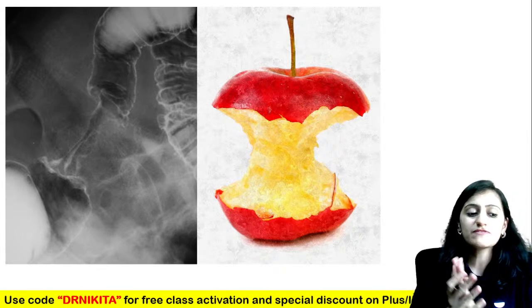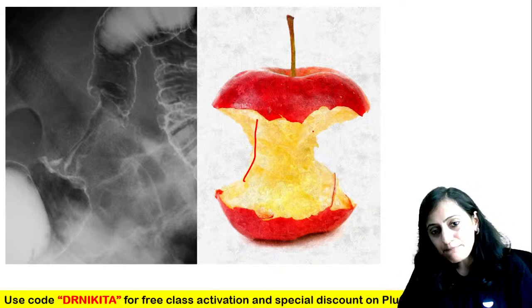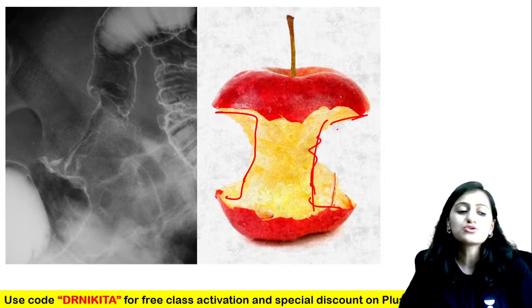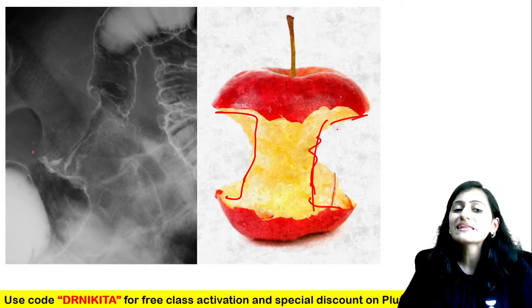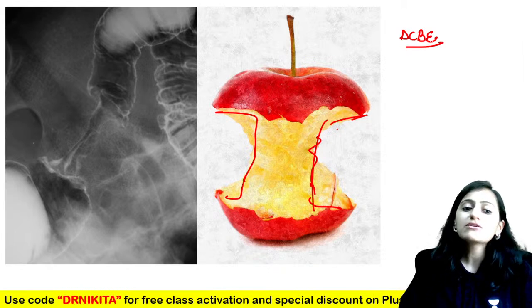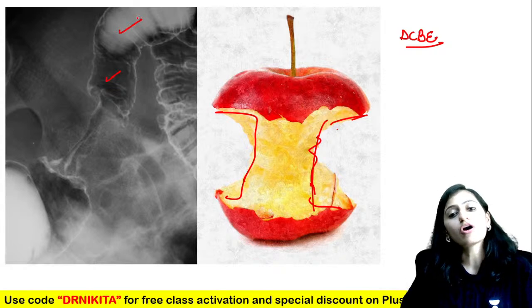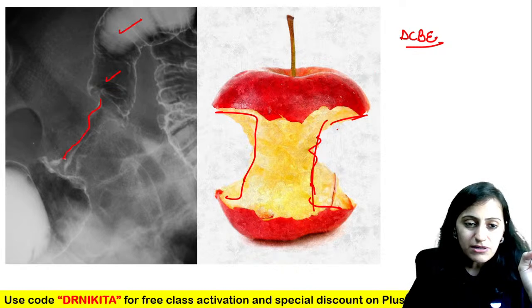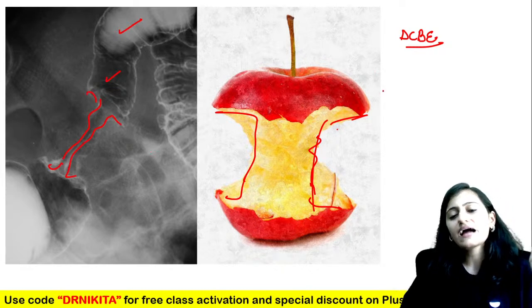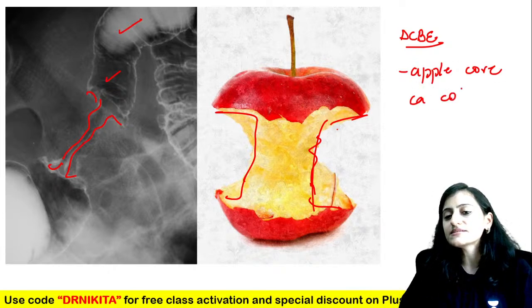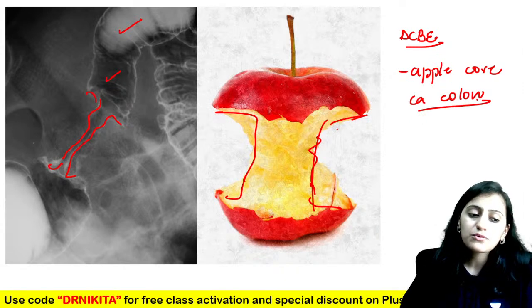This is the apple core sign — irregular narrowing with shoulder-like appearance. The investigation is barium enema — this is double contrast barium enema because you can see both the white barium and the black air. This apple core narrowing is suggestive of carcinoma colon.